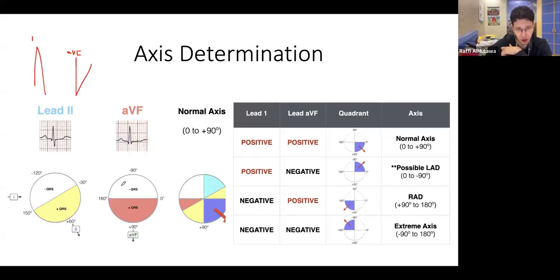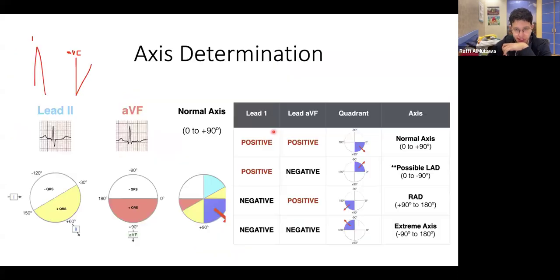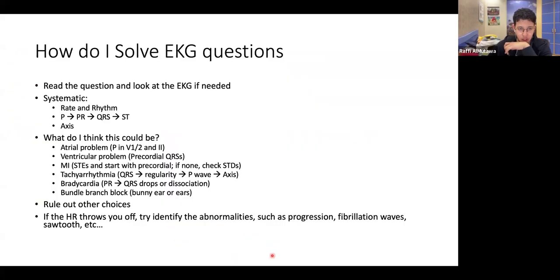This is just to show you how it looks and how they decide whether the axis is positive or negative. It's a little bit detailed, not really worth going into, and not too important. As long as you understand this, you're fine. But if you want me to explain it, I'm more than happy to. And this would basically be the end of the intro lecture.